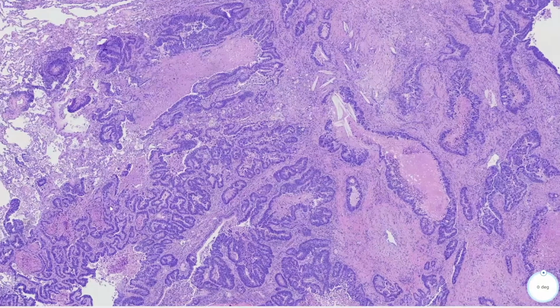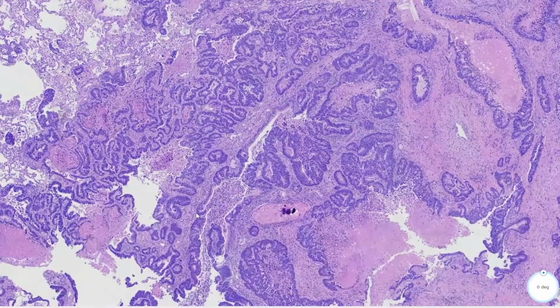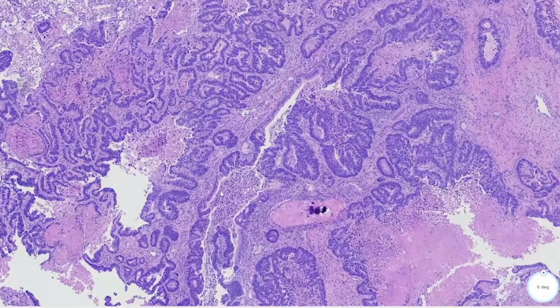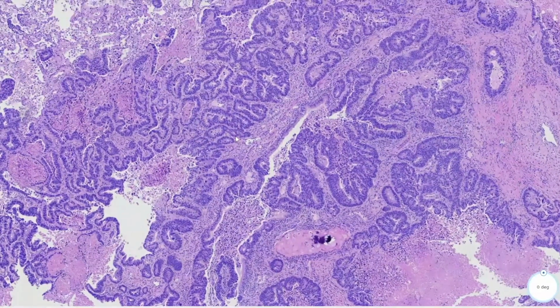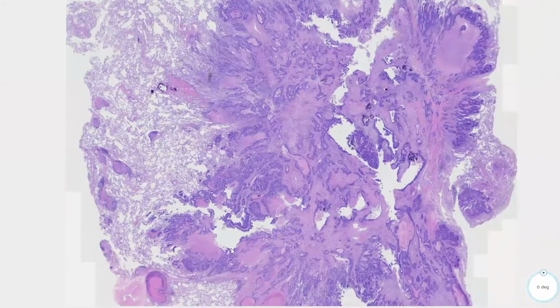And so in terms of some information around metastasis, metastases are often the most common pulmonary malignancy we see. If we look at an autopsy series, the lung is the third most common site for metastasis after lymph node and liver. Common metastases that we see in the lung include GI, breast, and head and neck. And you can also see metastatic sarcomas and melanomas. Classically, at low power, these will be cannonball-like lesions, which are well circumscribed, and that's how you'll see it on gross as well.